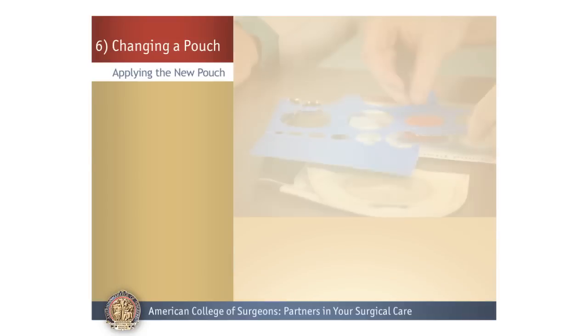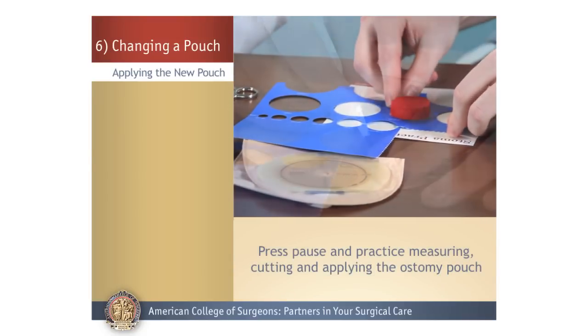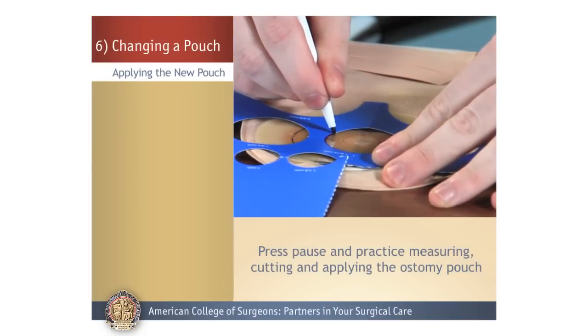Okay, so let's pause as you measure, cut, and apply your pouch to the ostomy practice model.